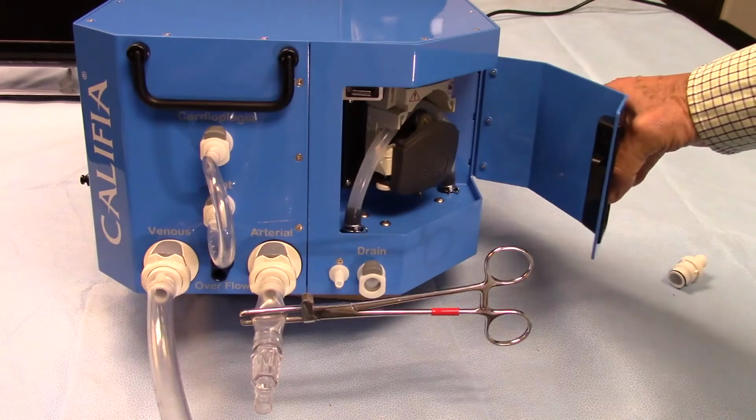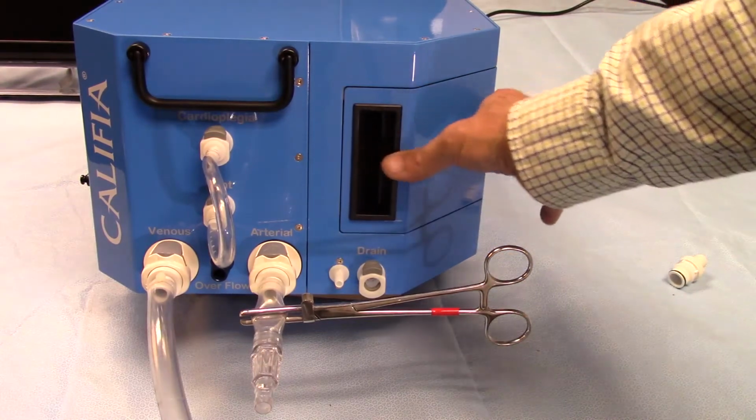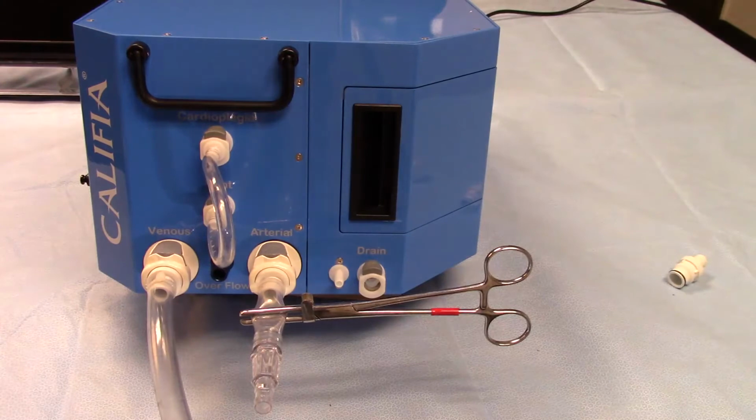Oh, the other thing that we wanted to talk about a little bit was the presence of this heart pump. We'll get back to that later, but for now, these are all the elements that we need to consider for hooking up to an ECMO machine and getting it primed.